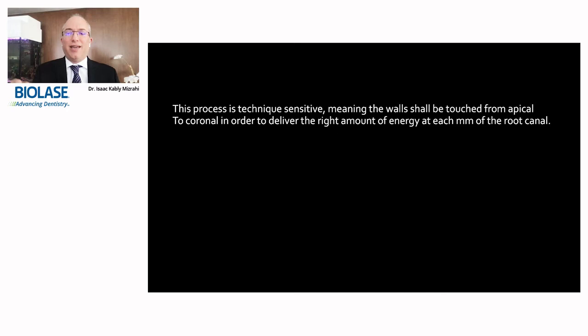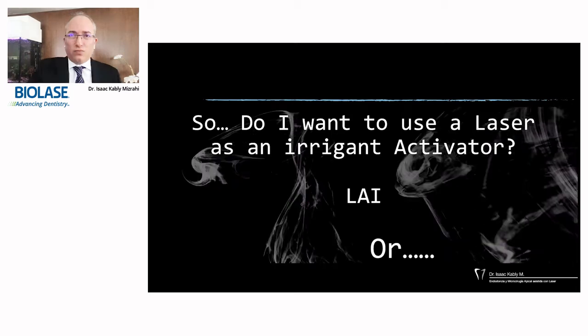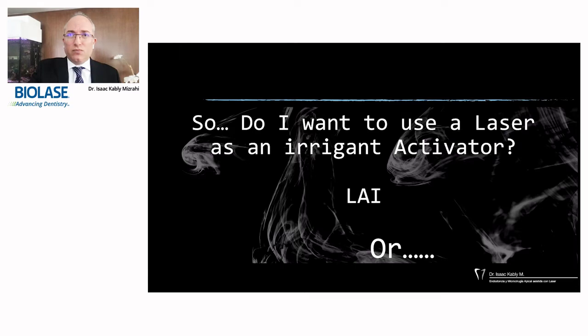So the question here is, do I want to use lasers to deliver energy to a liquid in order to clean a root canal? Or maybe I'm thinking differently now, and what I want to achieve is different.